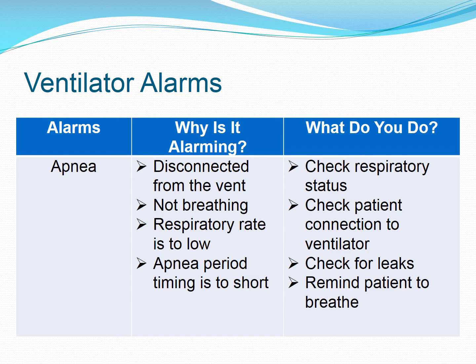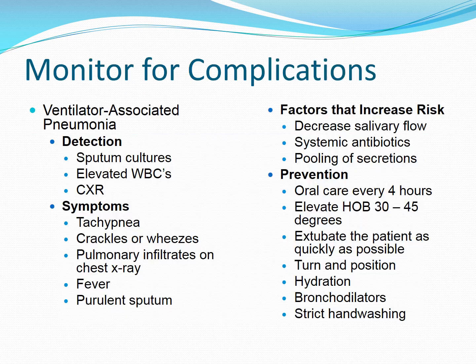Again, if this alarm is going off and you're not able to problem solve it, then what you need to do is bag this patient, and you need to contact respiratory therapy and have respiratory therapy problem solve that vent. The other thing that you have to do is you have to monitor for complications.